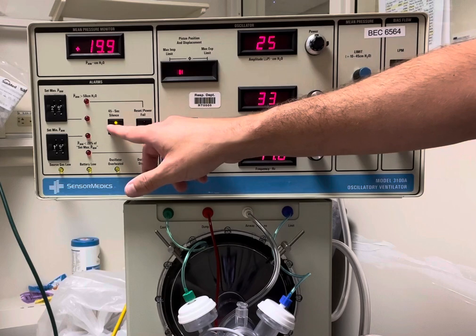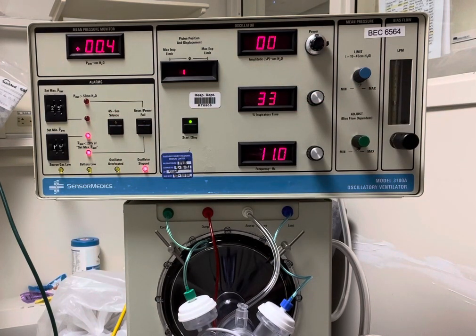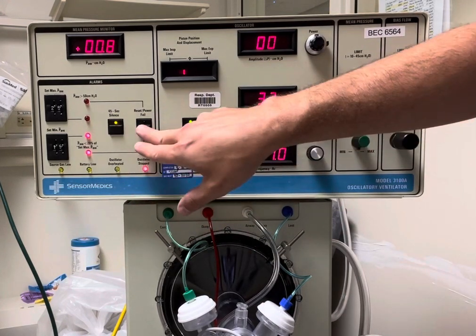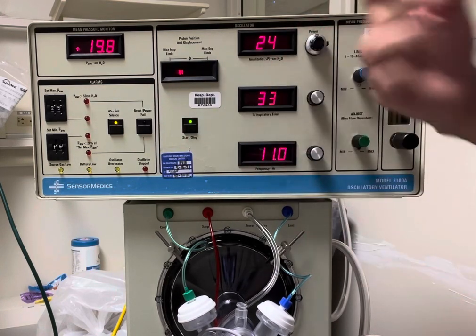Now in the event that you do have a circuit disconnection, you would have this power fail and it'll start alarming. You go ahead and troubleshoot the vent, silence the alarm, hold down this button, you'll see the pressure build, and then it would start.